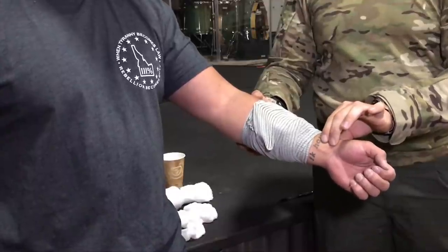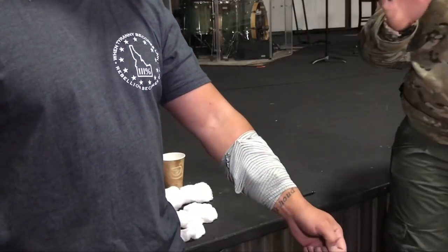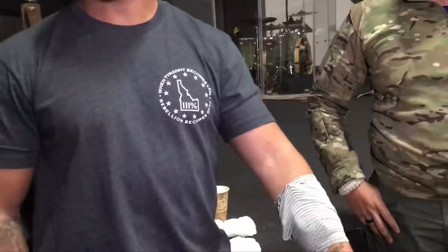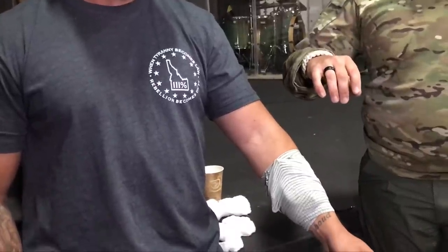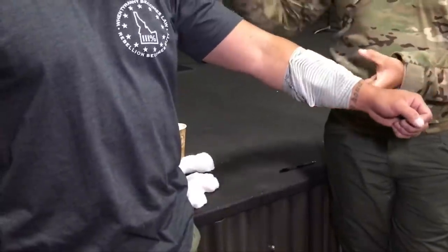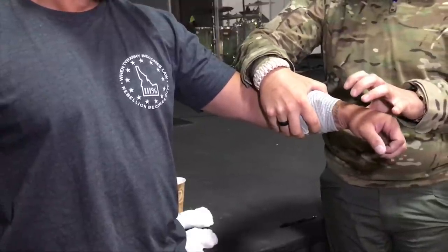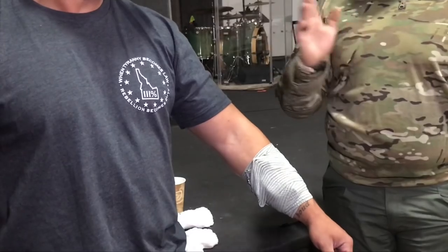Check for that pulse again — I've got a good distal pulse still. I want that pulse. If I'm looking at an absolute necessity for a tourniquet, I'm probably going to lean that way prior to the Israeli trauma bandage. The reasoning behind doing that twisting halfway through is because maybe the bandage is just pushing out the blood and not really clotting it — that's why you twist it a little, just to give a bit more tightness. Remember pressure, remember elevation — these are all good things, it's stopping the flow of blood to that wound. The more pressure I can create, the better within reason. I still want good perfusion — I don't want his fingers turning blue or those veins popping out. I still want good blood flow to that area, but I also want that bleeding to stop. Finding that middle ground is ideal.